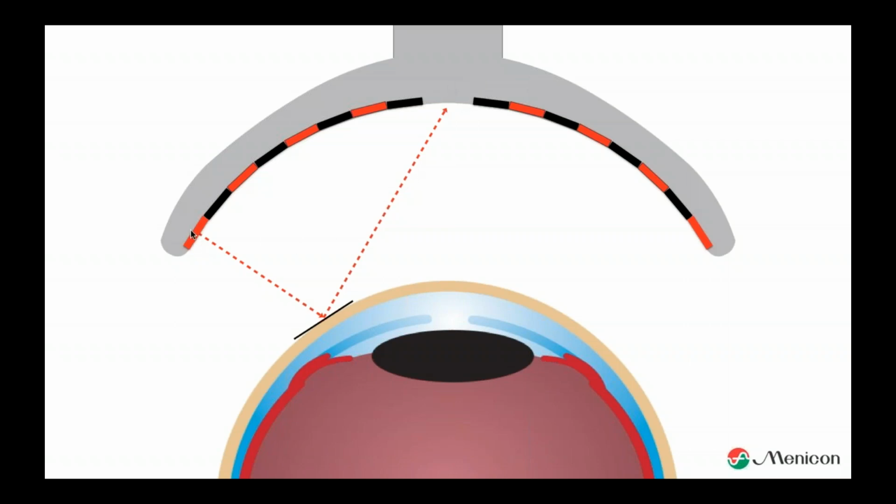It only says, okay, I put some light source out and I want to get it back. But if you have light bulbs on in your room, maybe the computer screen or just light spots above the head, and it's reflecting as well, it will also enter the measuring device, which causes a problem for the topographer. He cannot decide which light ray to use, so you will end up with mistakes, with false measurements. So it's also important to always do your measurement in complete darkness.